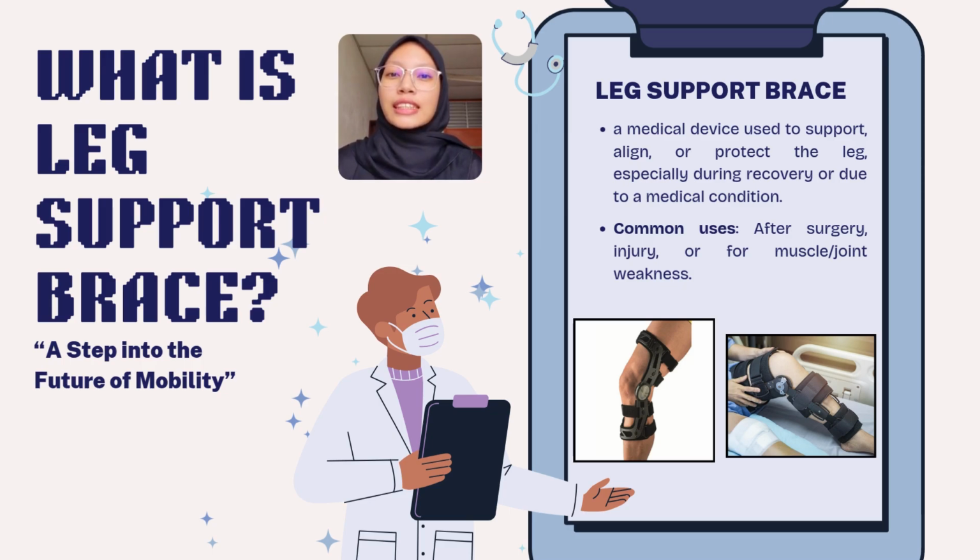A leg brace doesn't just support the leg, it gives people a chance to stand with confidence, to move without fear, and to reclaim a sense of independence they might have lost. Behind this simple looking tool is a clever balance of rigidity and flexibility. It has to be strong enough to support joints, yet gentle enough to allow movement. It works closely with the body and not against it.